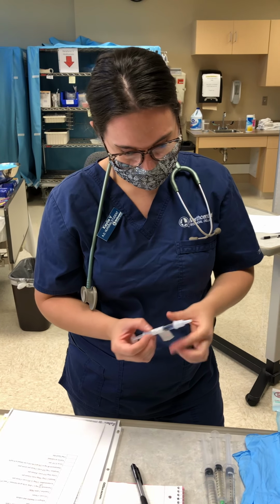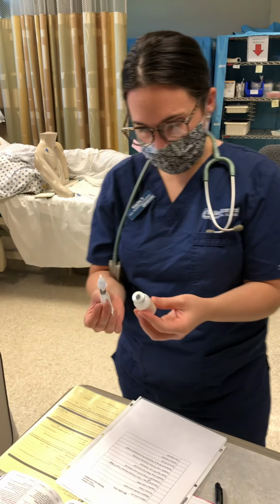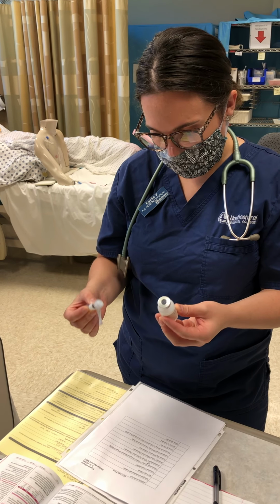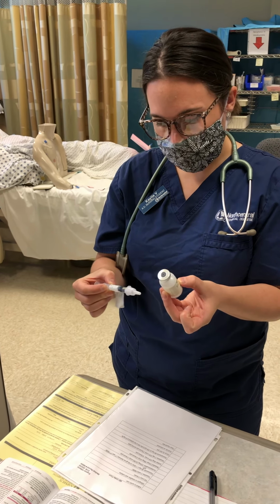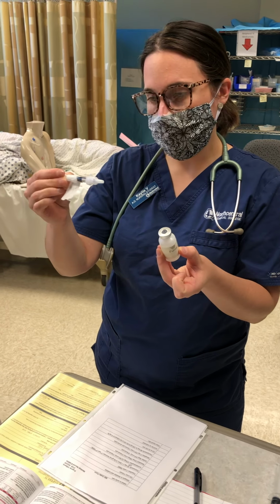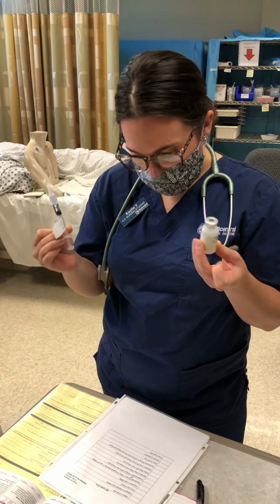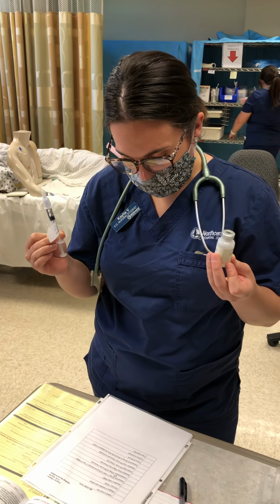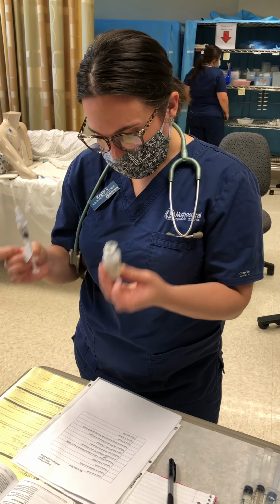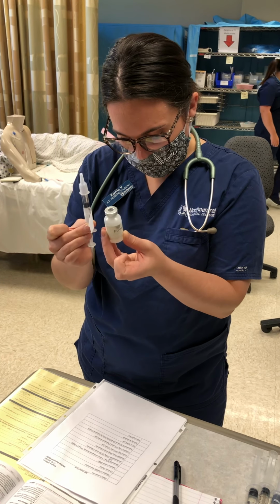that I pre-made. Take my furosemide, grab my MAR, and I'm doing my checks, make sure I have the right stuff. So first thing, I have patient Eugene Williams, date of birth 9/22/45. I have furosemide, 80 milligrams in 2 mLs. So in this dose I have 40 milligrams, which is the order for 1 ml. Due now before his second pack of red blood cells. Given IV push.